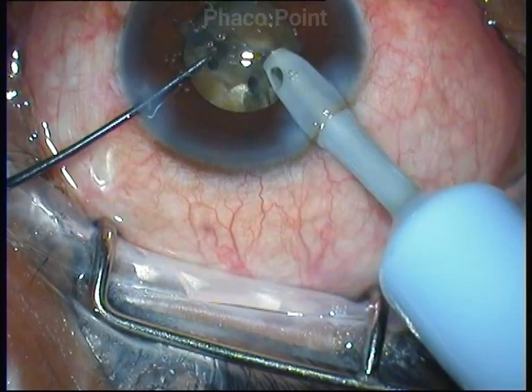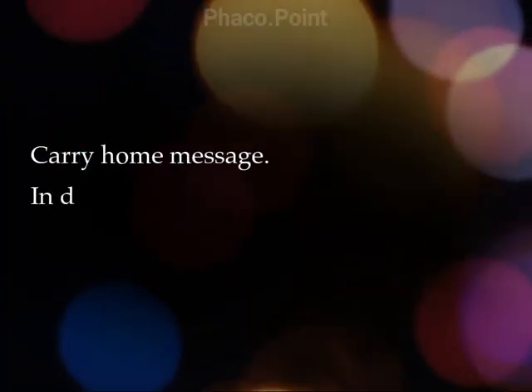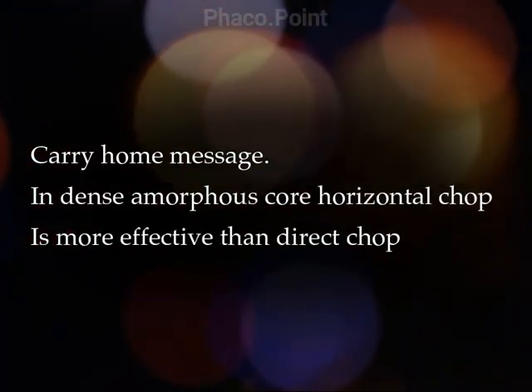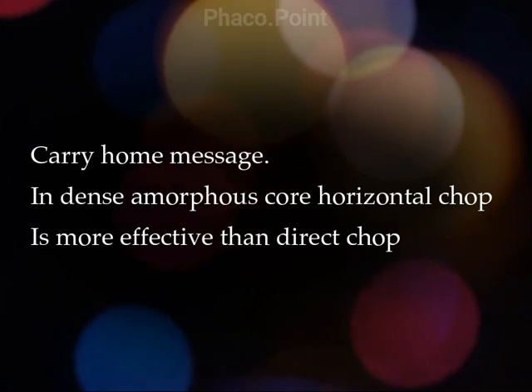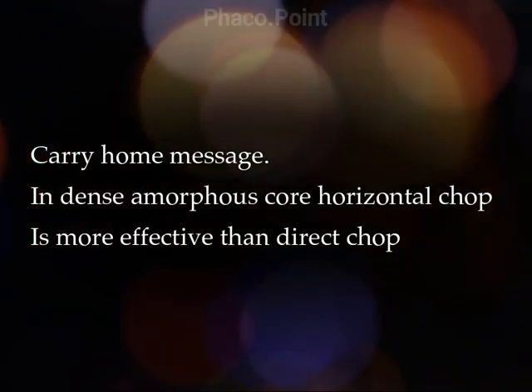So the take home message is that in case you have a dense amorphous core, then the most appropriate and probably the most effective way of disassembling this nucleus is to employ a horizontal chop maneuver that uses compressive force rather than a direct chop that uses shear force.